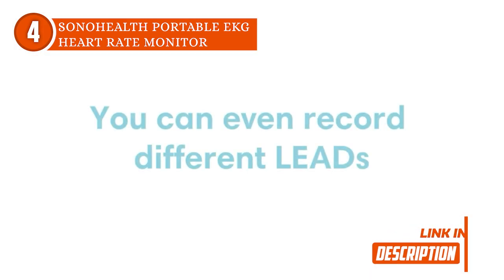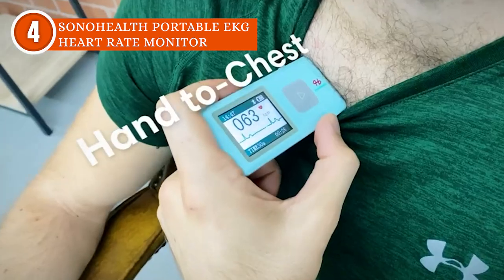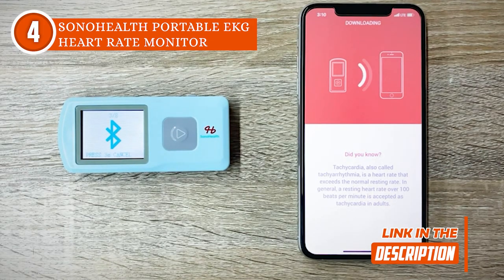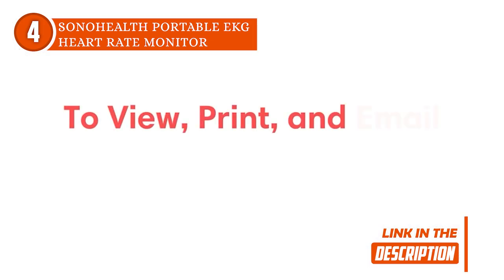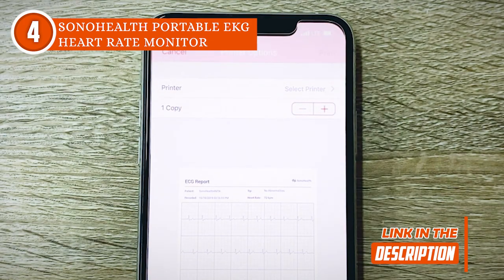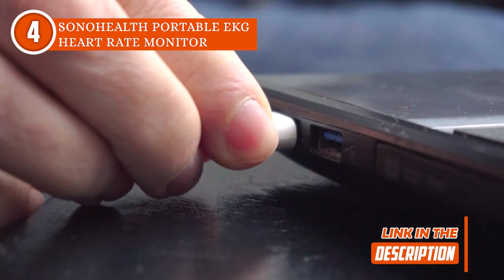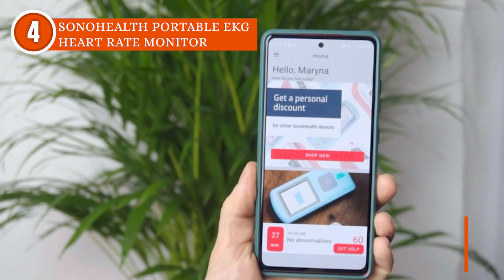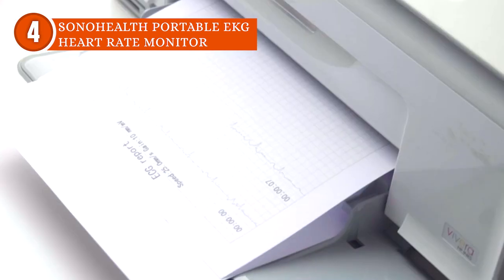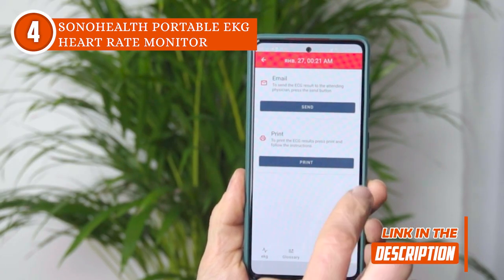The SonoHealth Portable EKG Machine gives an easy-to-use and digital experience to its customers. You can connect this device with your smartphone app, which is compatible with both Android and Apple devices. Once you connect to the app, you'll get limited free storage without having to pay for a subscription. Another great feature of this ECG monitor is its speed — once the app is open and your fingers are on the device, it only takes 30 seconds to get an accurate ECG. And since it has been approved by the FDA, you can always use it to spot atrial fibrillation.